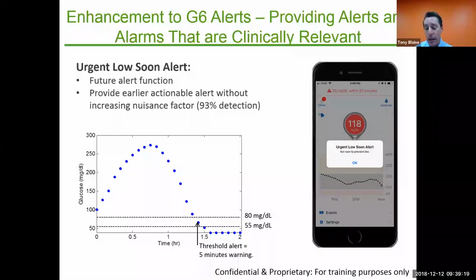So patients love it because most often when a patient experiences a low glycemic, hypoglycemic event, it's at nighttime. So they're already sleeping, they're not awake and consciously checking what their glucose levels are. And so if it drops below that, now they know that their Dexcom's got their back, it's gonna beep, it's gonna vibrate, and it's gonna wake me up. And then they typically keep a fast-acting glucose by their bed so that they can get some glucose in them quickly.